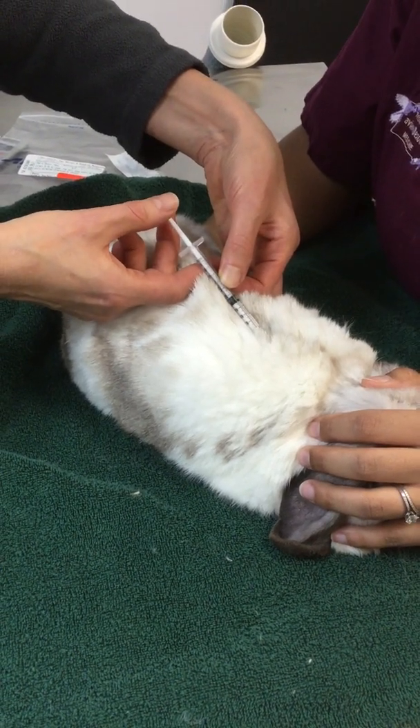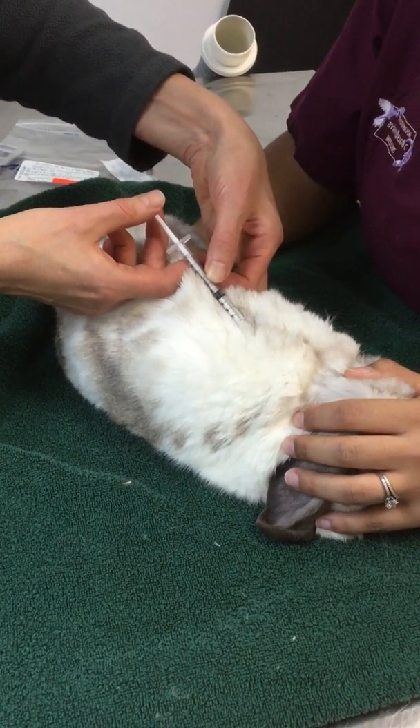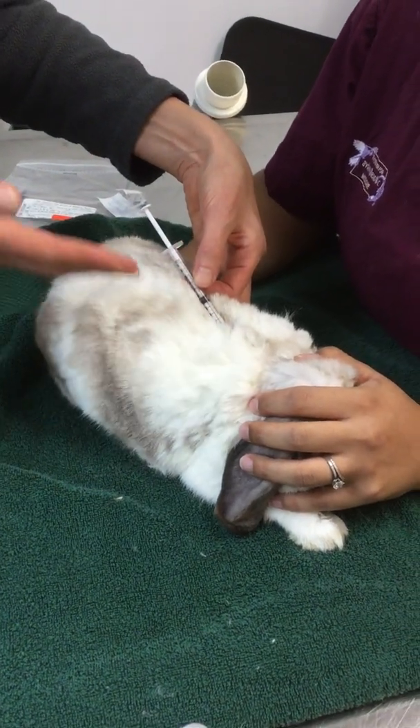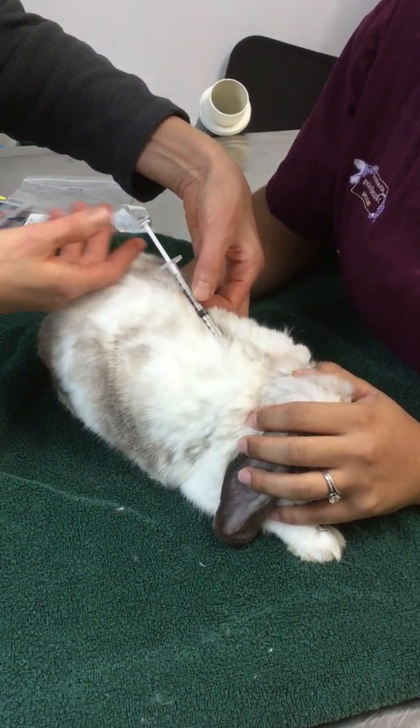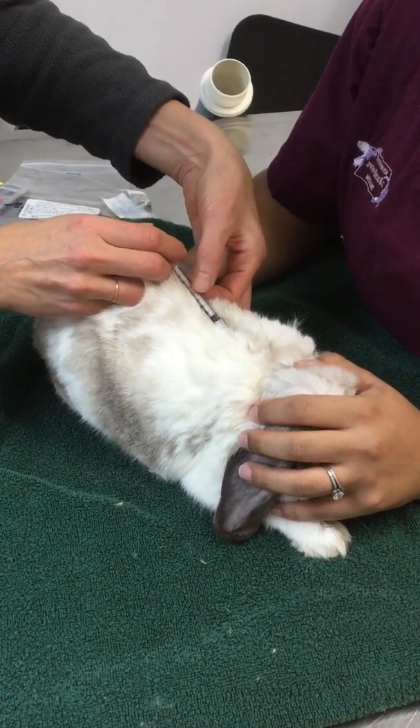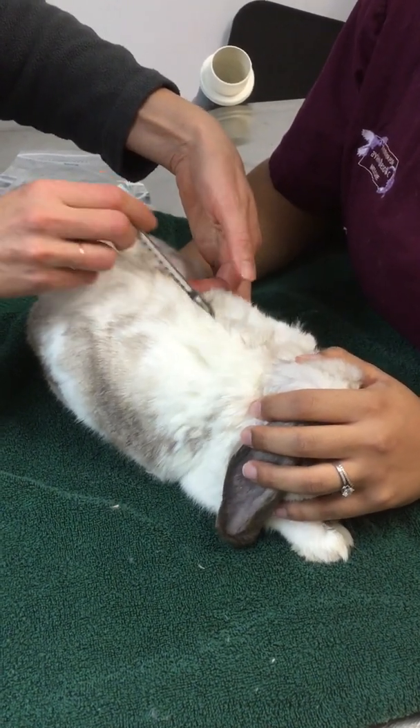That's called the negative pressure. That means I know I am now inside the skin — I am not in the air. If it was air, if I went through, it would just draw back air. I'll show you what that would look like in a minute. But for now, I'm going to go ahead and give this injection and pull it straight out.